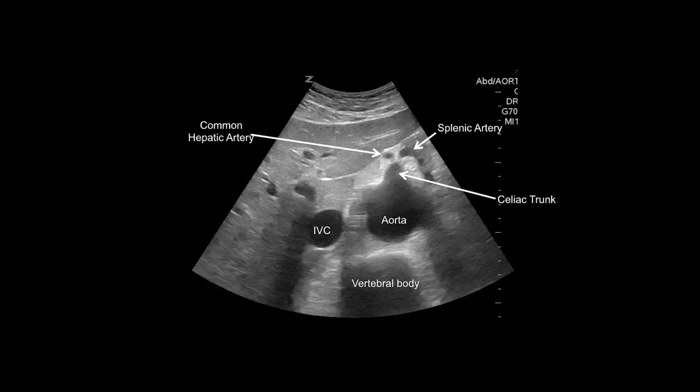Our next objective is to find the celiac trunk and the SMA. These branches may be difficult to see and will take some patience and small adjustments of the probe to bring into view. Occasionally, bowel gas will obstruct these views completely. The celiac trunk is the most superior abdominal branch that can be observed on ultrasound. You can see the trunk in this image arising from the aorta, traveling anterior and bifurcating. The bifurcation of the trunk is sometimes described as the seagull sign, as it appears like the wings of a bird.